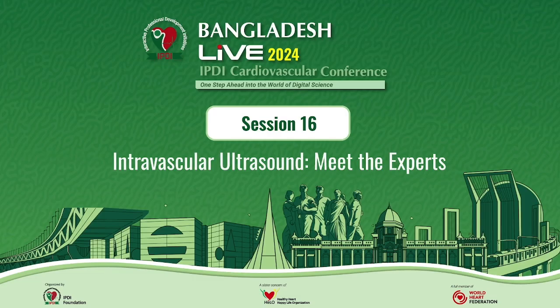You did the left main with a mid LAD lesion, pre-dilated the left main, then you did the FFR in the mid LAD. Why did you do FFR in the mid LAD? Why not IVUS in the same setting? We also did the IVUS. So what was the IVUS finding? The IVUS is borderline. When the left main lesion is there, how much opinion will the mid LAD FFR give you?